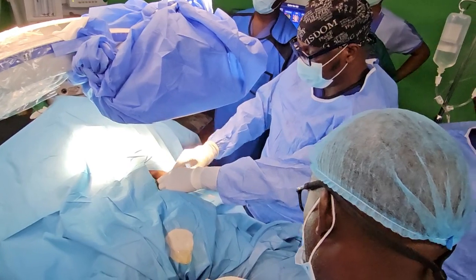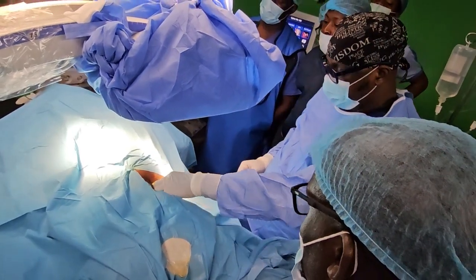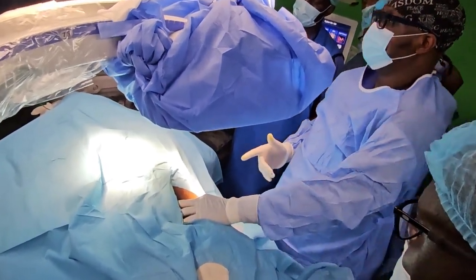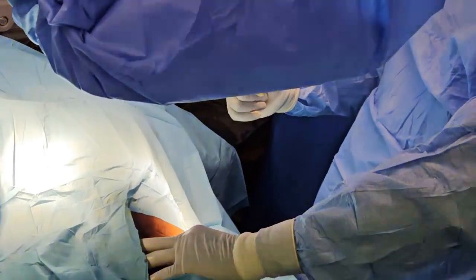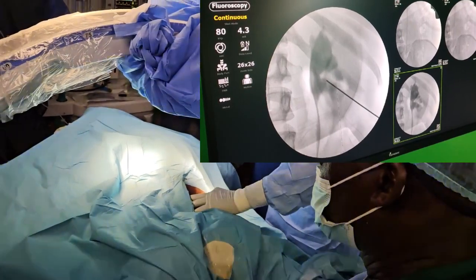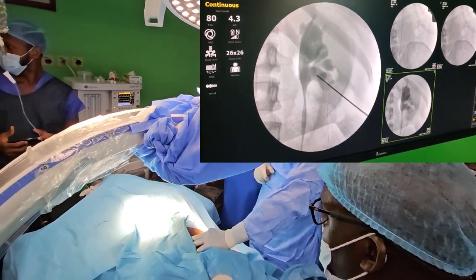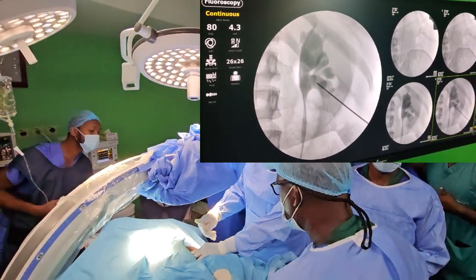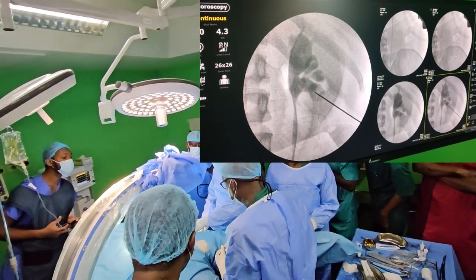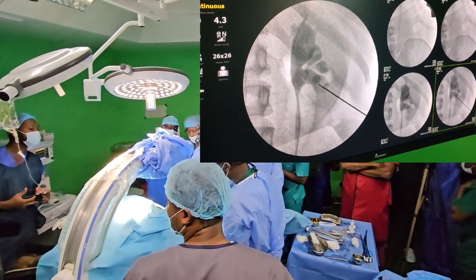What I usually do is a gradual descent technique. Rather than go through this exact point down, that's bull's eye. If you look at it, that calyx looks like it's facing me. It looks so beautiful, it's facing me. You can see that oval shape. So if I bull's eye on it, it might be good. But I would like to come a little here and then go this way, still on the same line. Can you see?